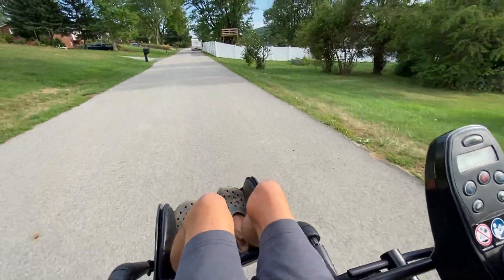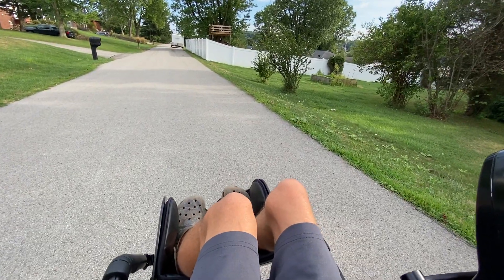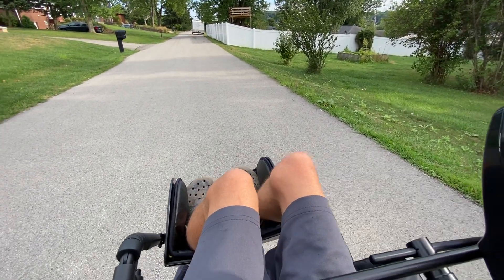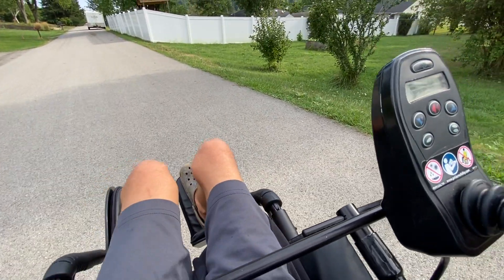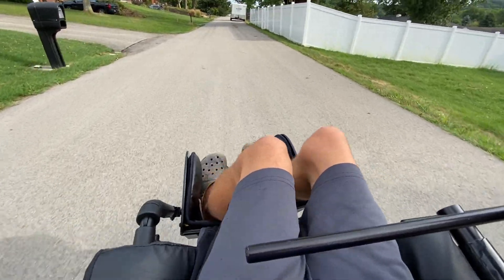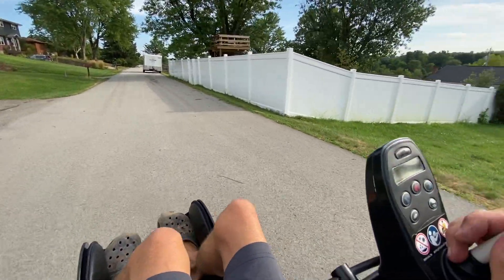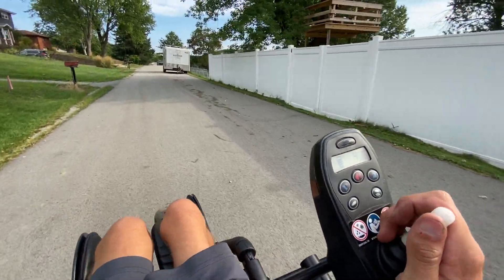The nice thing with this chair is it has two different styles of braking: progressive, where if you let off the stick it comes to a nice gentle stop; and if you need to emergency brake, just pull back and it stops almost instantly. My M41 doesn't have that and I really wish it did.